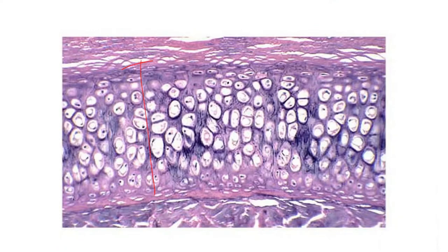All right, from here to here, what jumps out at you? Well, what jumps out at me are eyes in the jungle. I see the eyes in the jungle, and I think, hey, that's cartilage. That's a hint I'm looking at cartilage. And the next thing I want to look at, when I get past the chondrocytes that are in lacunae, and that's what all the eyes in the jungle are, is the matrix. Take a look at the matrix. Does the matrix look clean or dirty? Well, it looks dirty, right? It looks cracked. This is not smooth stained glass. It's cracked. So this would be elastic cartilage. Where's the location? Say in the epiglottis or the pinna of the ear. It does provide support, but some elasticity to that support.